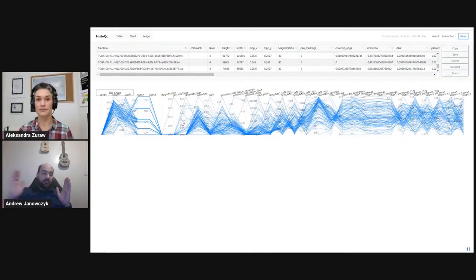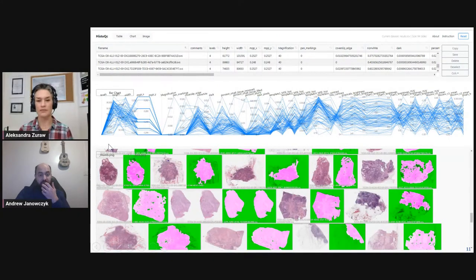We're computing many, many different features. And we can now see there's about 94 slides visible here. So now you're not looking at one slide at a time. You're looking at 100 slides at the same time. And you're starting to see how those slides are starting to interact. And then the bottom part, you see the original image.